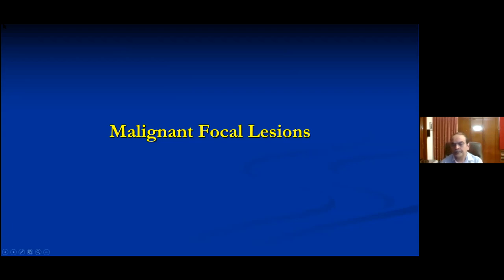A few more related to HCC. The next one is Jayanta from Calcutta. He's asking, how can we differentiate capsulated HCC and liver abscesses in a CT scan? I think allow me to go through the spectrum of HCCs, and I'll take this question in the second part, because by the time I would have highlighted the features. And specifically, any indications of image guided biopsies for diagnosing HCC? Or should we ask all the questions related to it? I think that may be better if the questions for HCC come in the second part of the talk.